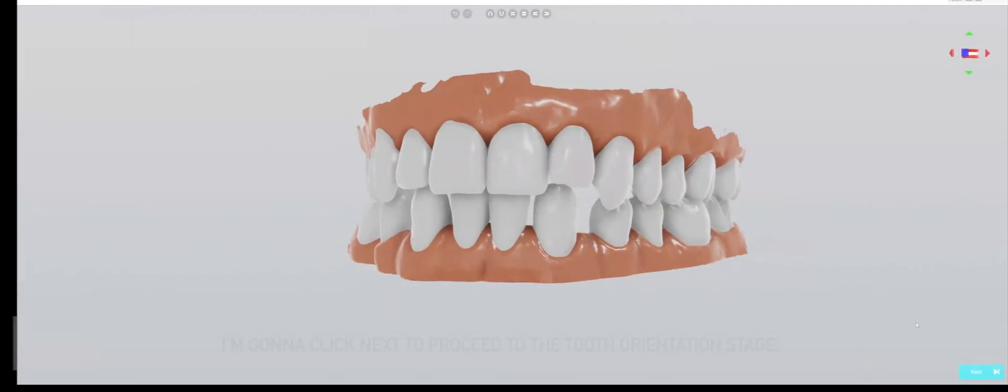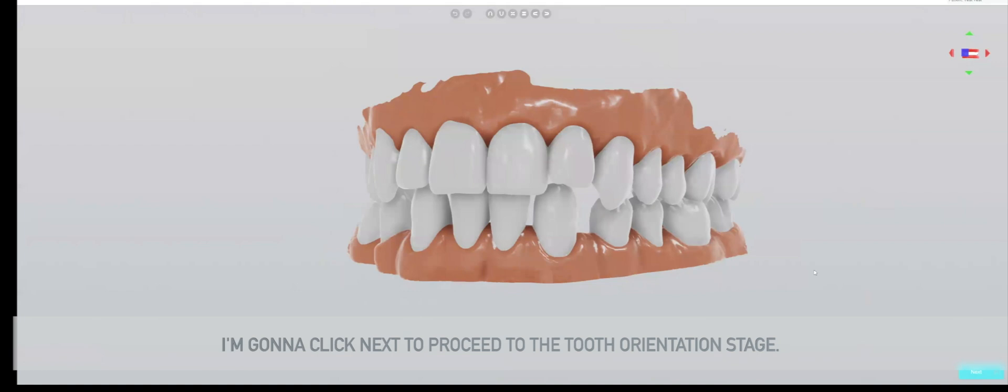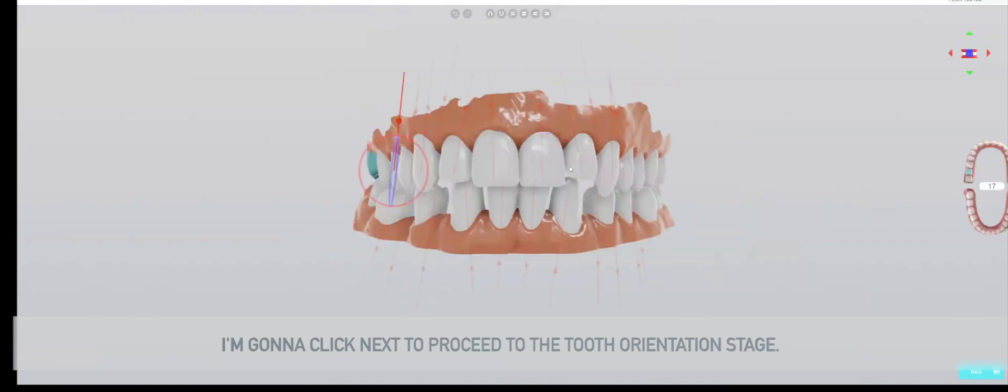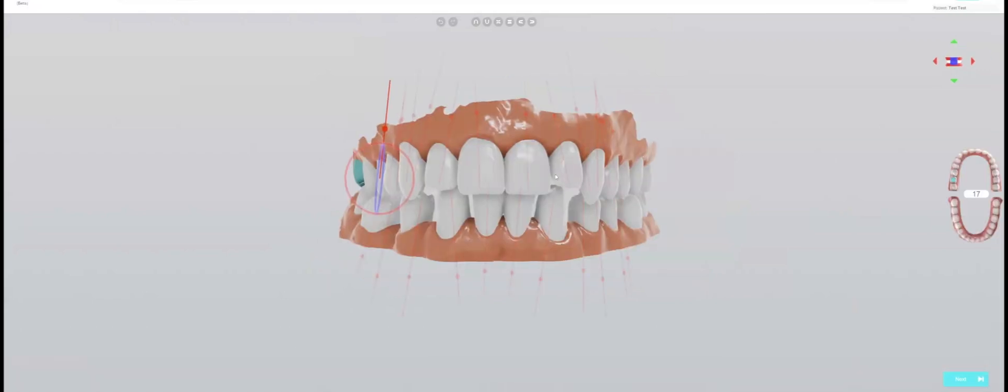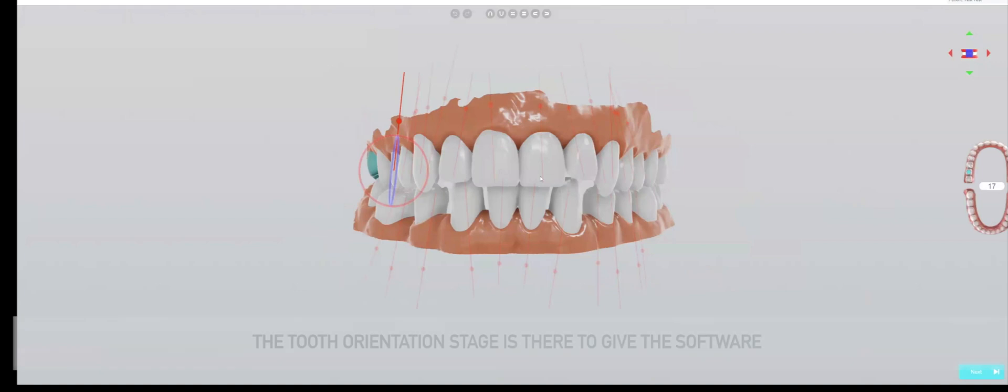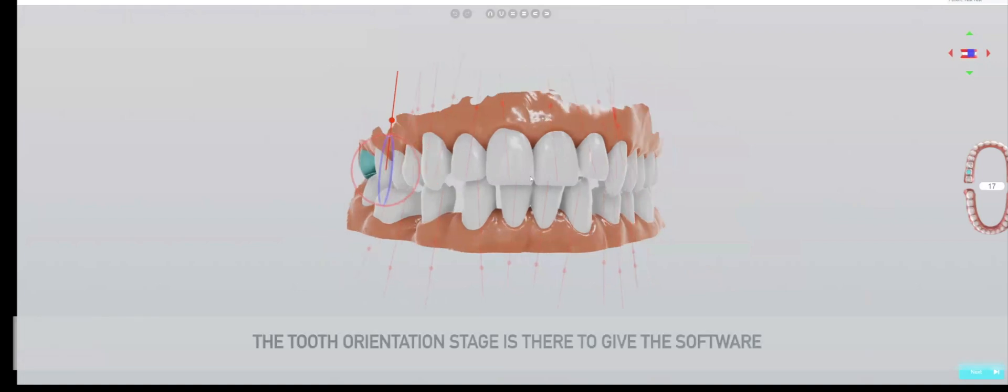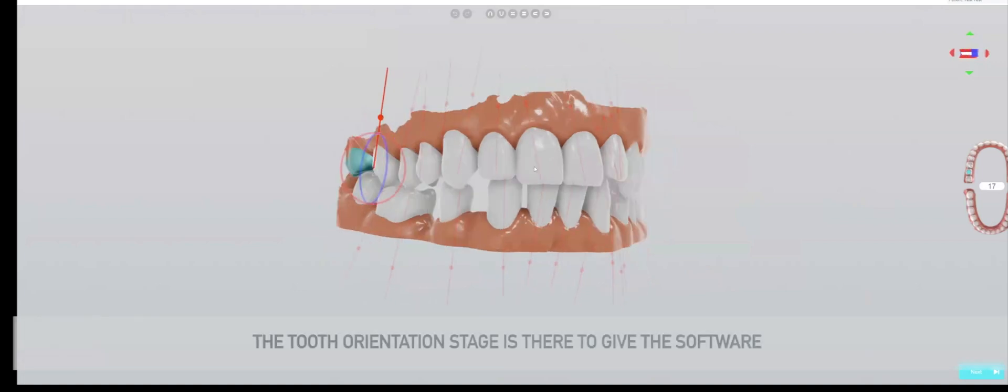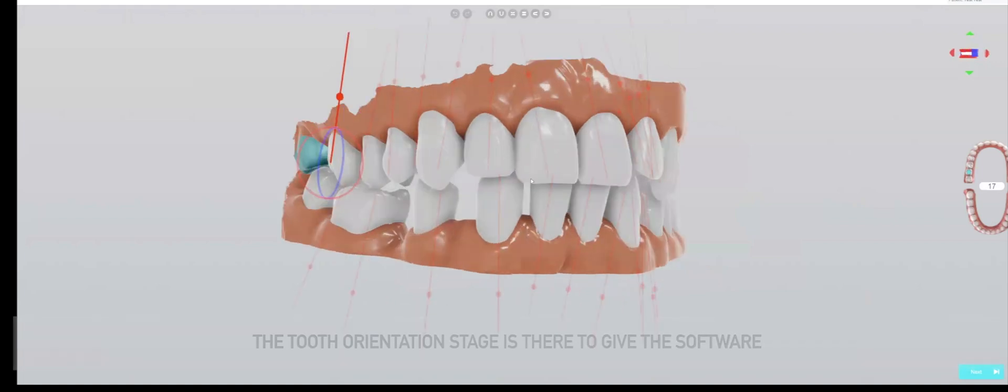This looks perfectly fine to me, I'm going to click next to proceed to the tooth orientation stage. The tooth orientation stage is there to give the software an idea of where the roots should be directed towards.